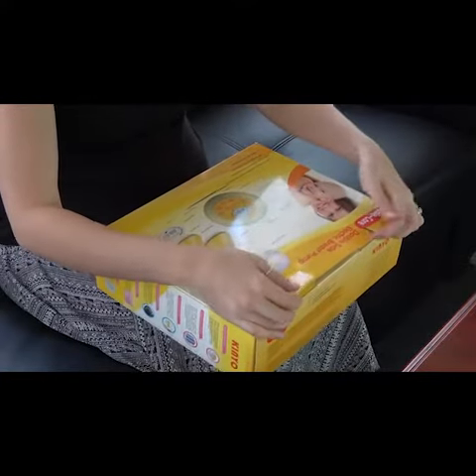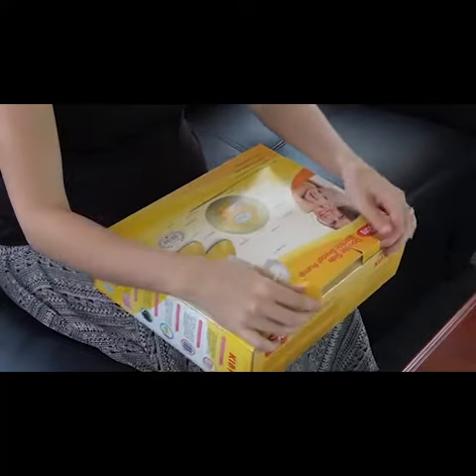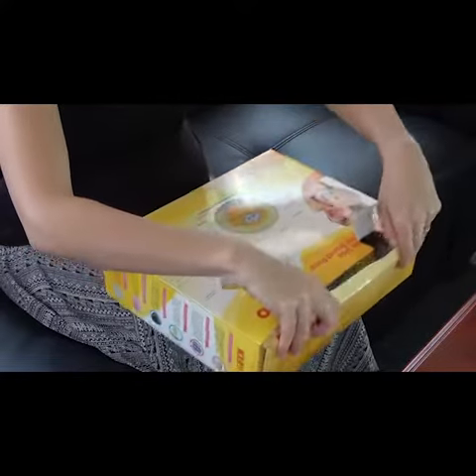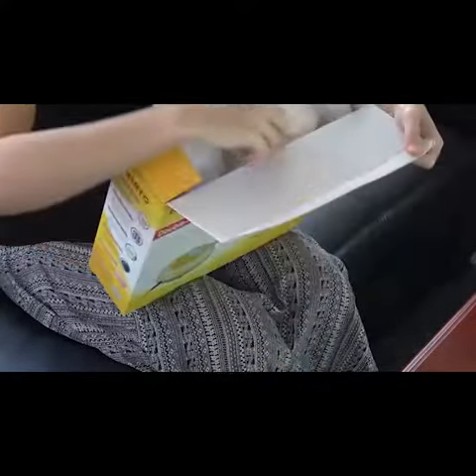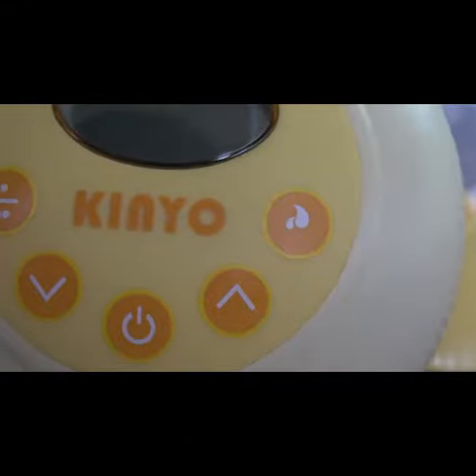The Kinyo electric double core breast pump works on the simple principle that less is more. Less fuss, less noise, and less stress equals more breast milk and more time for more enjoyable aspects of motherhood. The Kinyo breast pump has a patented pumping mechanism renowned for silent function, so it's the quietest breast pump available.